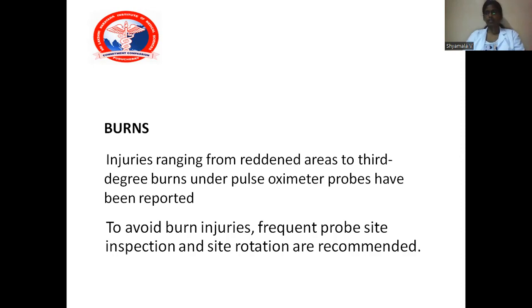Then the other condition is carboxyhemoglobin, which is formed when hemoglobin is exposed to carbon monoxide; its absorption spectrum is almost similar to oxyhemoglobin, which causes false readings. Severe anemia will overestimate the SpO2 level at low oxygen saturation levels.